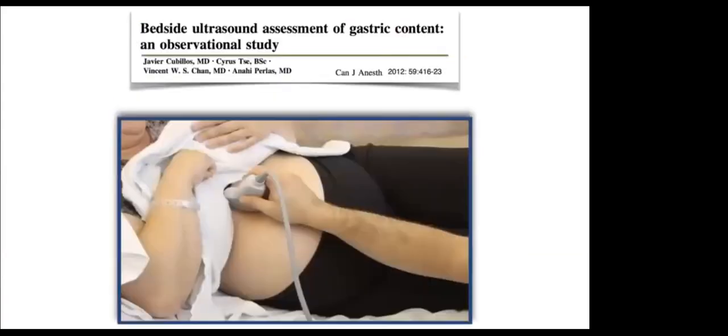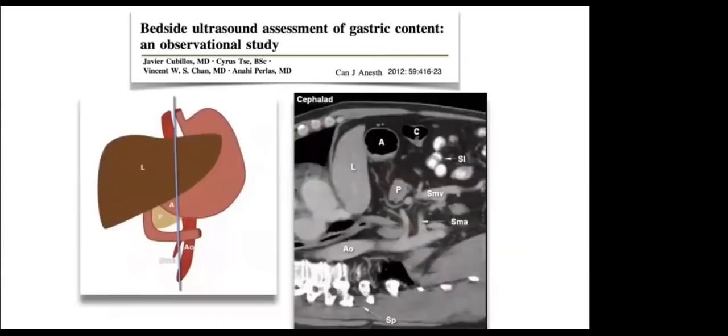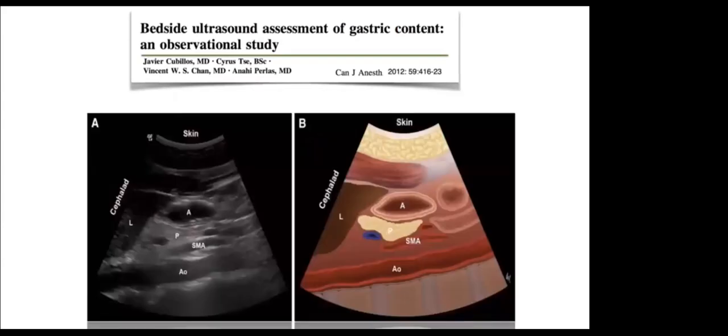Sagittal view. This is a pregnant patient, so it is feasible. You're going to go through the liver, the left lobe of the liver, in order to access the antrum. And the sonoanatomy that is relevant is the aorta at the bottom. On the side, you have the liver, and along the free border of the liver, you have the antrum.